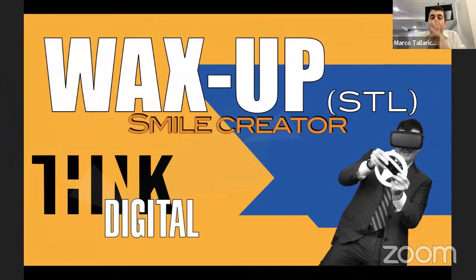So just 1 minute to introduce the Smile Creator, and then I want to share with you some cases using CBCT scan, intraoral scanner, and Smile Creator. Smile Creator is just an aesthetic workshop, but also a functional workshop. So the concept is to create a digital pre-visualization of the teeth to be rehabilitated from an aesthetic and functional point of view, and then to generate an STL file of this simulation. Because, as I told you before, we need a DICOM file from the CBCT scan, we need an intraoral scanner STL file, and we need a workshop to prosthetically drive our implants.